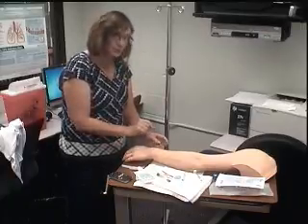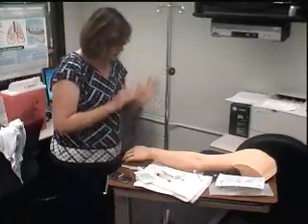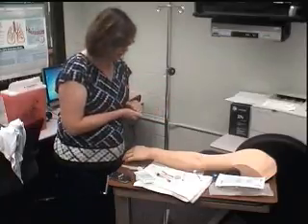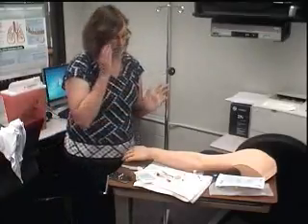The needle comes out and the little catheter will be left in. So I tell them what I'm going to do. I've identified them by name and date of birth, checked their allergies, and explained the procedure. I'm going to prime the saline lock and prepare the equipment.